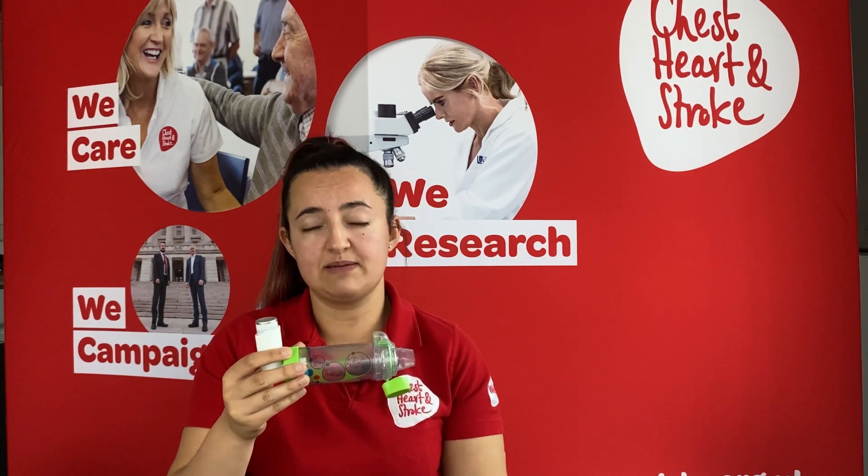Today I'm going to show you tidal breathing. This is a technique used when someone is having an asthma attack, as they won't be able to take a deep breath in.